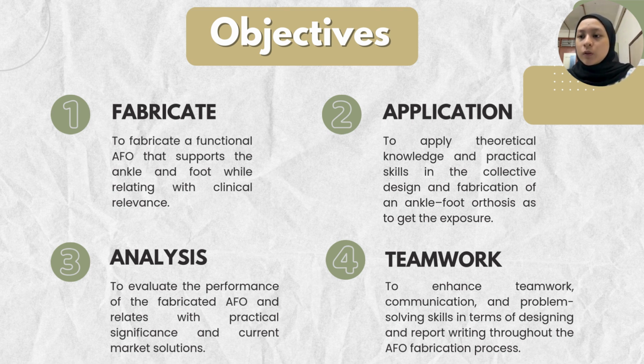The objective of this group project includes, first, to fabricate a functional ankle foot orthosis. Secondly, we are to apply theoretical knowledge while sharpening our practical skills as well as getting exposure. Next, we are to do analysis on the final product, and lastly, we get to build teamwork among group mates throughout the fabrication process.